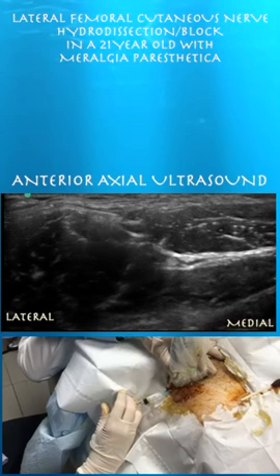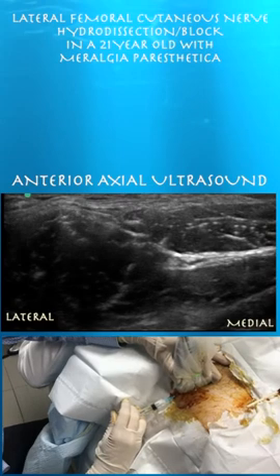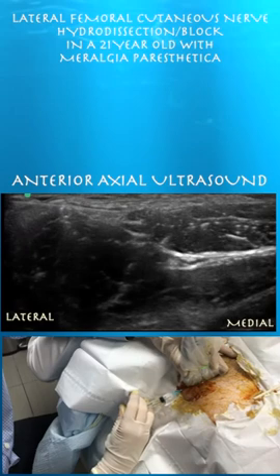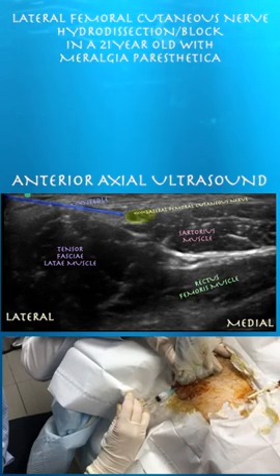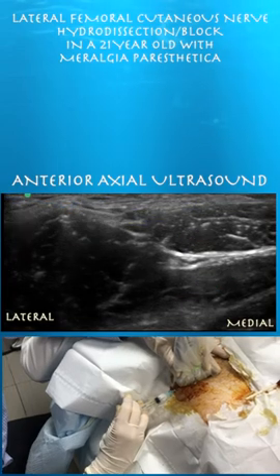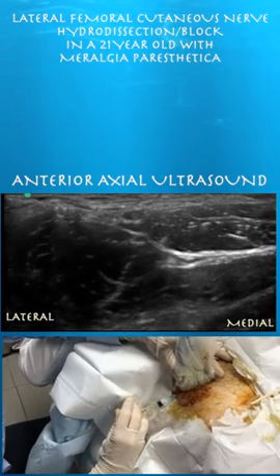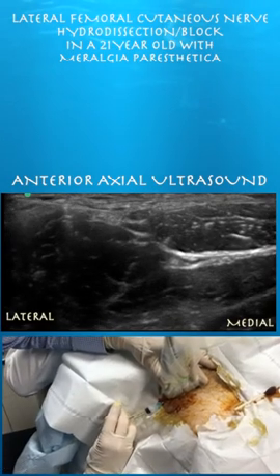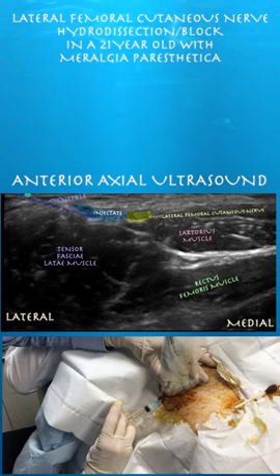It's almost like a hydrodissection type of technique. Here you can see some fluid going out of the needle tip. There's the nerve, there's the needle — sartorius, rectus femoris, tensor fasciae latae muscles. Other than the lateral femoral cutaneous nerve, there's not much neurovascular structures here to worry about. Here again you can see more injectate surrounding the lateral femoral cutaneous nerve, hopefully helping this patient's symptomatology.